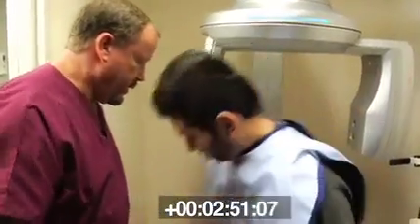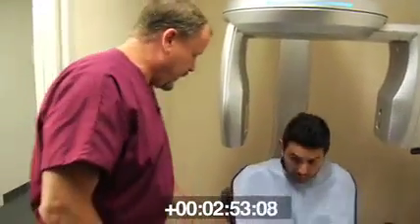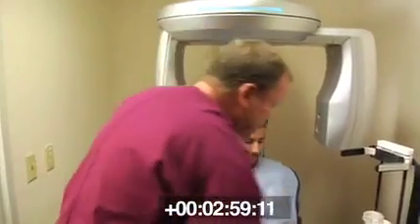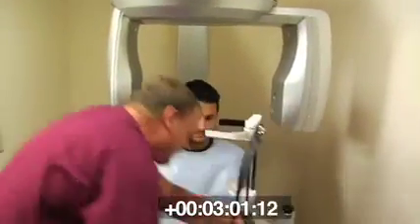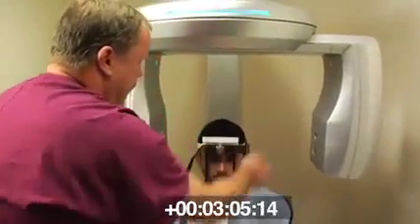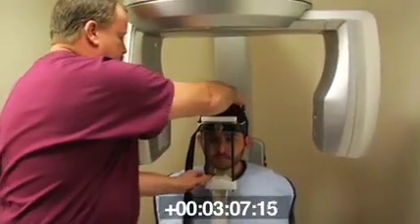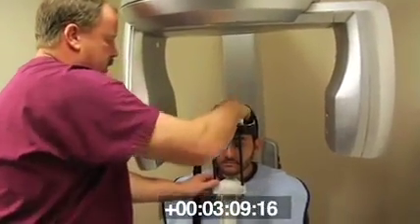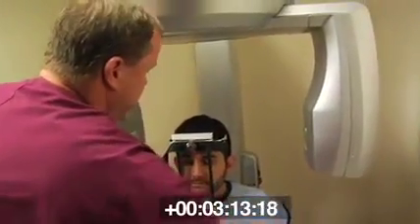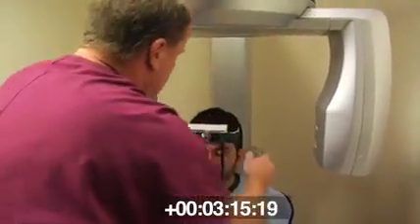So if you have a seat there, push all the way to the back of the chair. Very good. And what we have is a chin rest that's going to swing around in position. And we're going to try to extend our patient's neck to the fullest there. Tip it forward till you touch right there. I'm going to run this up just a little. Still touching on the front? Okay, so we're still touching.